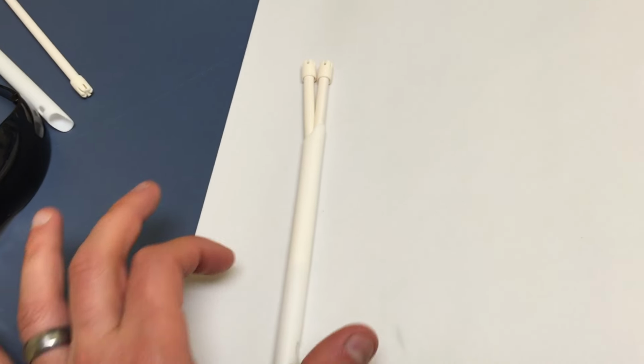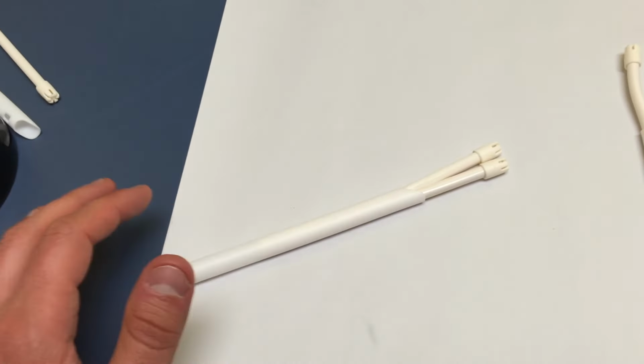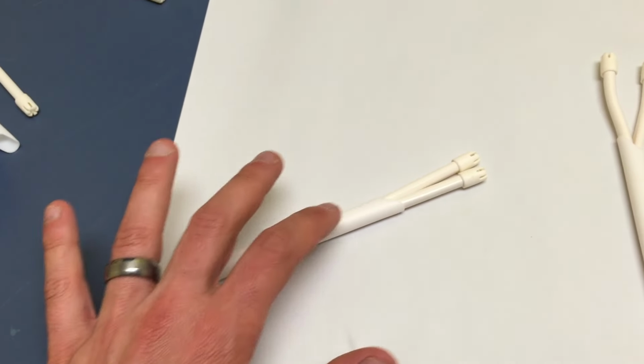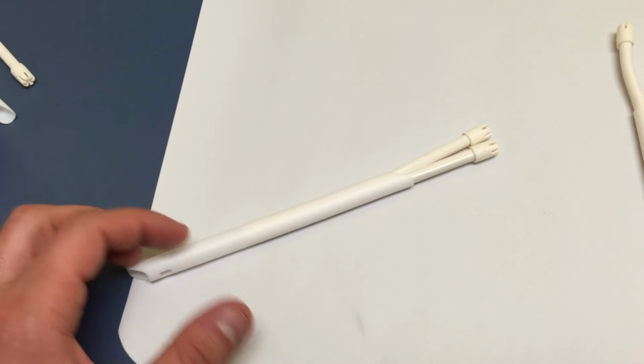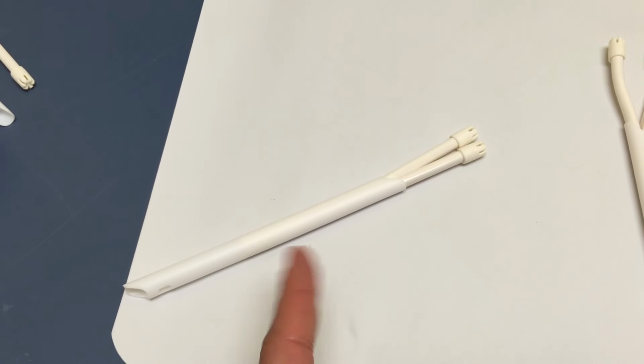A couple of weeks ago, I came up with this little trick with an HVE tip and two saliva ejectors. Basically, what I just did is take the two saliva ejectors and jam them into the HVE tip. It takes a little practice to get in there. It's pretty tight, but it'll slide in there. It's down to about here.